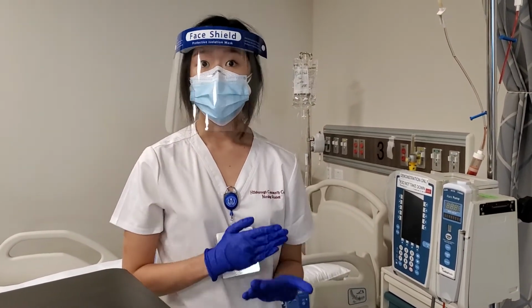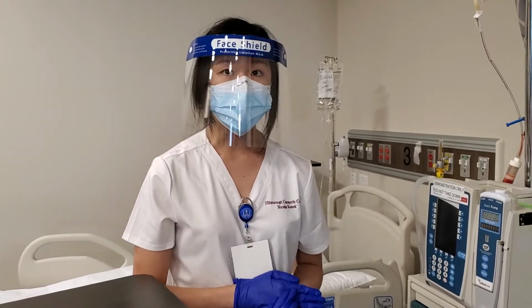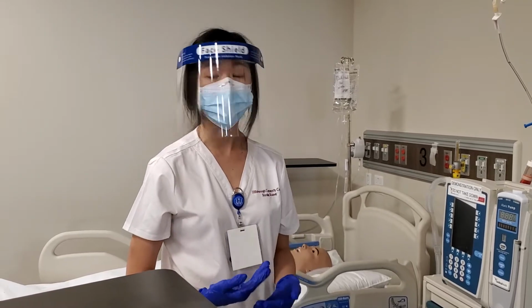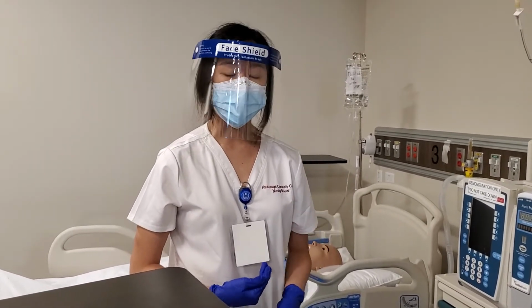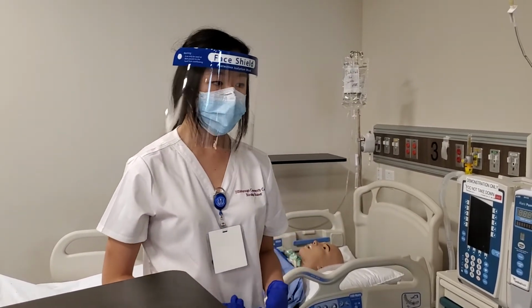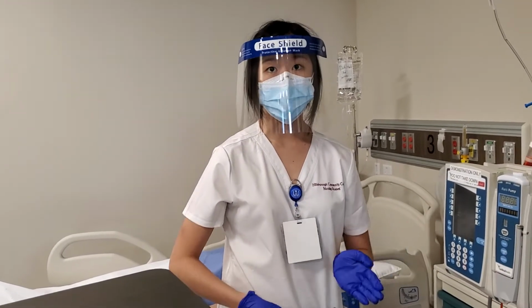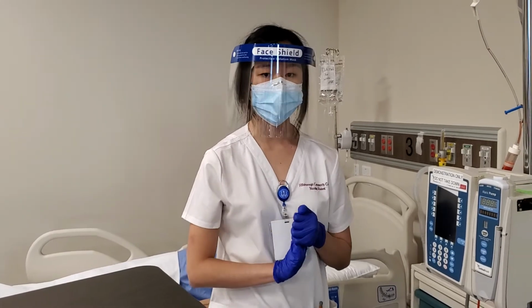And after the first 15 minutes, you need to take the patient's vital signs. And then afterwards, every 15 to 30 minutes, you need to monitor the patient again to see how they are taking the transfusion. And then the whole transfusion needs to be finished within 4 hours of receipt from the blood bank.